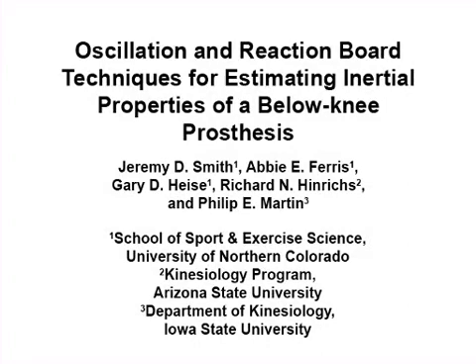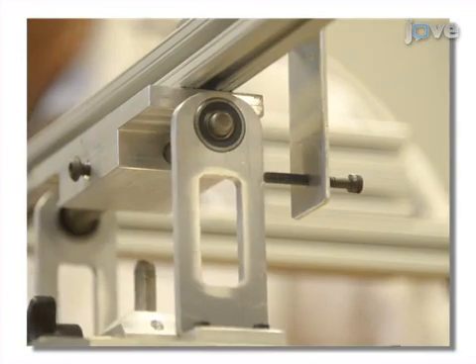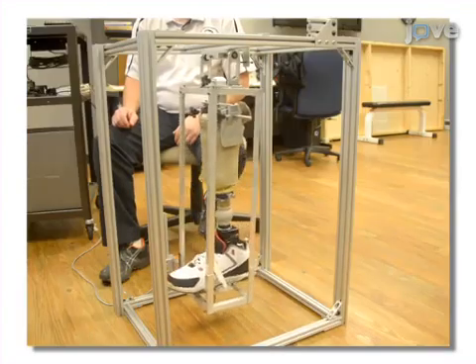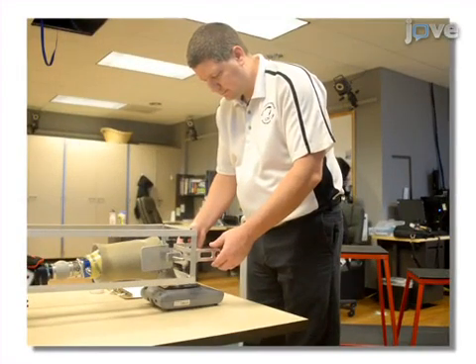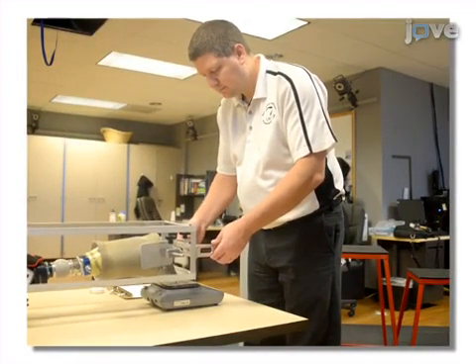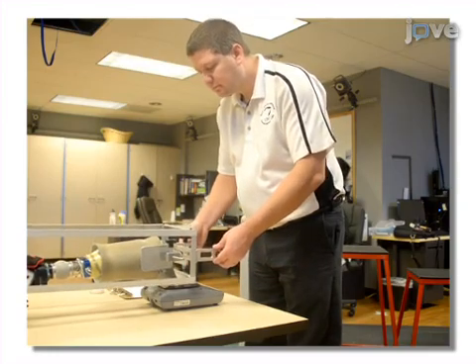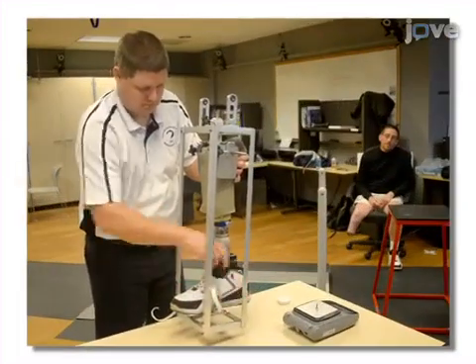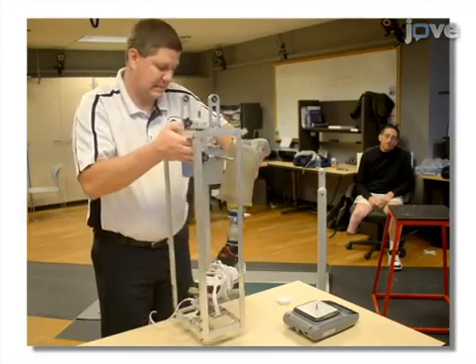The overall goal of this procedure is to estimate the inertial properties of a below-knee prosthesis. This is accomplished by first measuring the period of oscillation with the prosthesis suspended within a cage. The second step is to use a reaction board technique to estimate the center of mass location for the combined prosthesis and cage system.